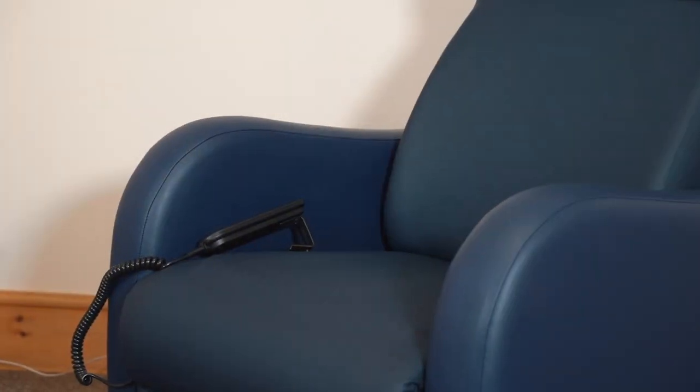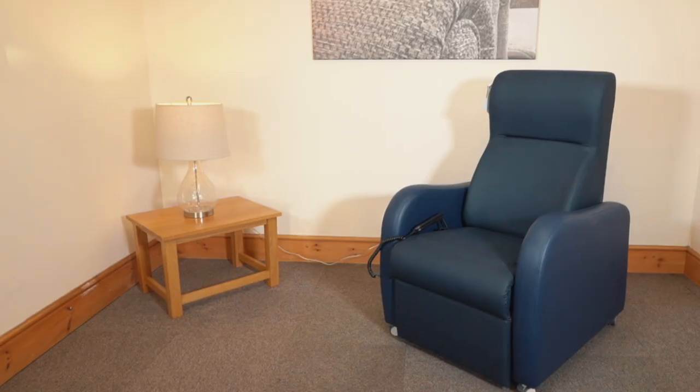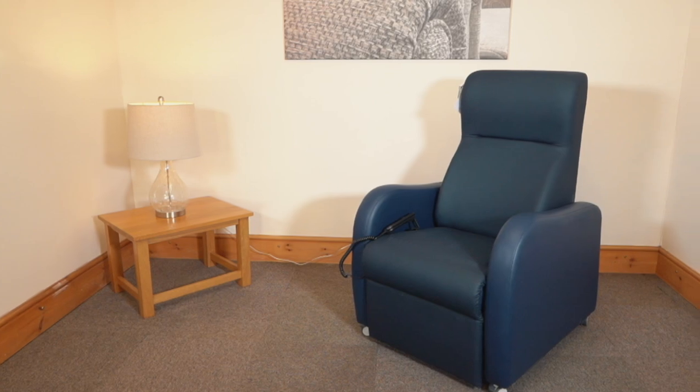Hi, this is Justina from Stuart Mobility and today we'll be looking at the Stamford from Repose Furniture. The Stamford recliner is designed for everyday use. It's ideal next to a bed or in a lounge of a care home, hospital or hospice.